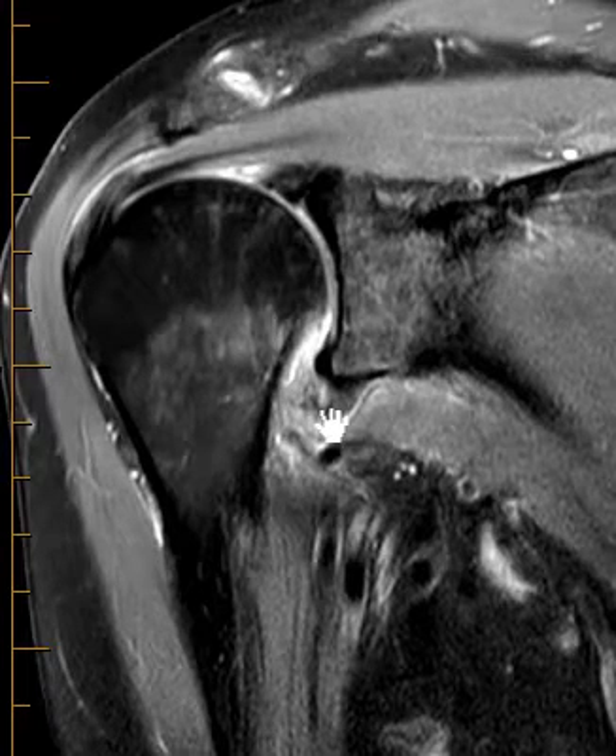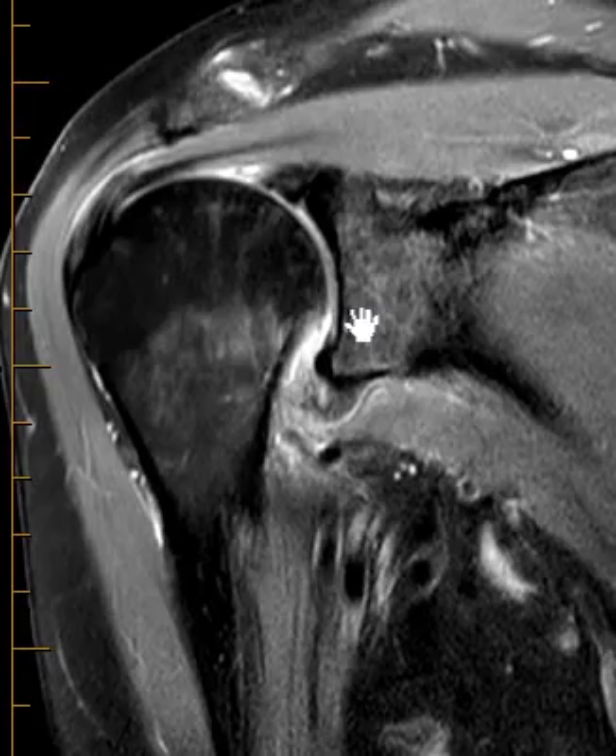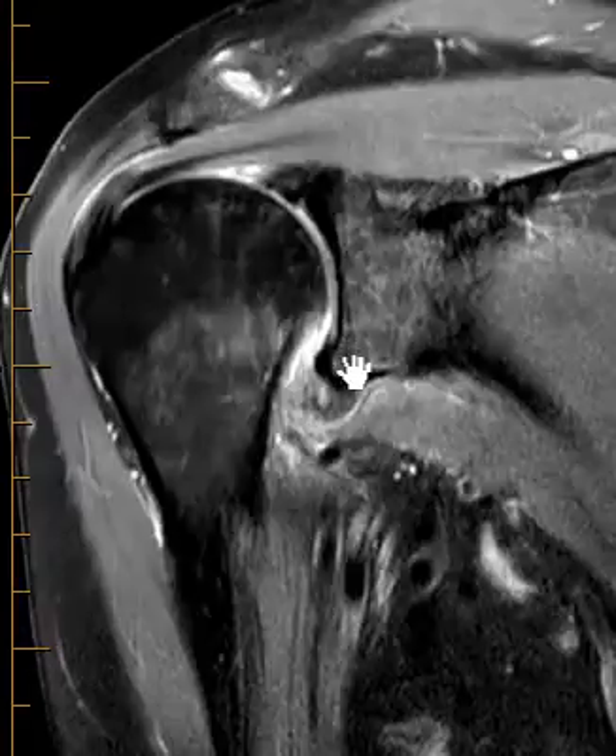They call this a HAGL lesion — the humeral avulsion of the inferior glenoid and humeral ligament. There's a little bit of fluid in the joint, and they also had a little tear of the anterior labrum.